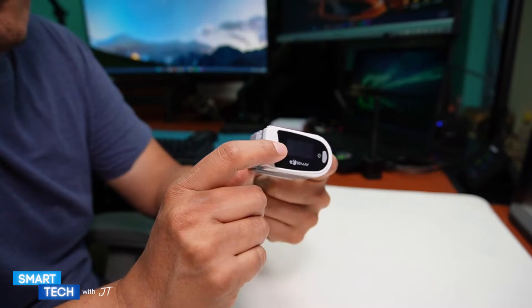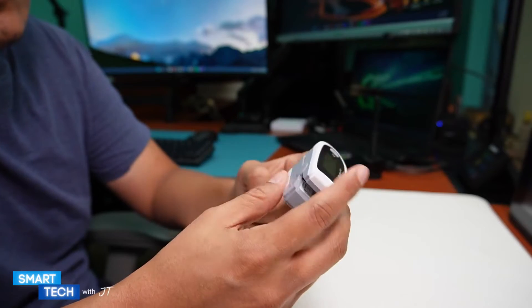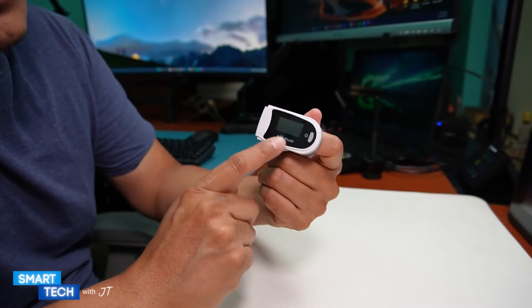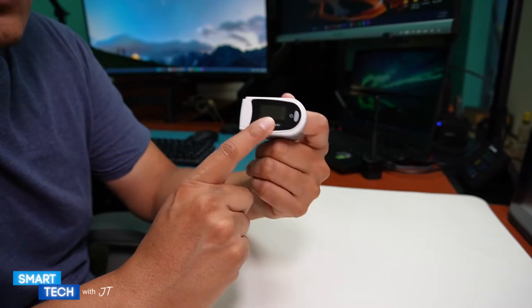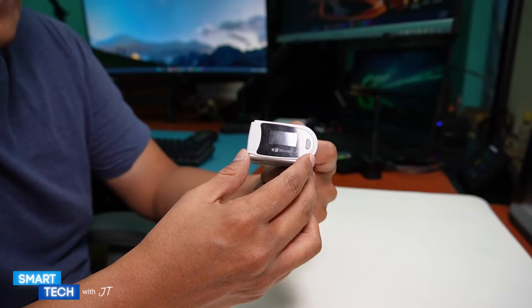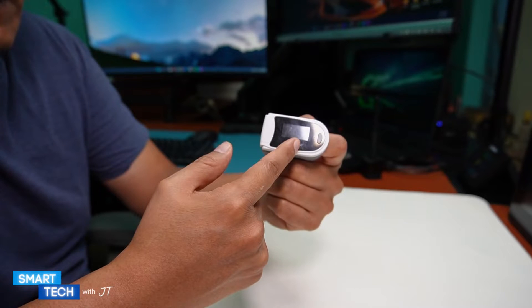It's a very valuable product if you're looking to register how your oxygen is doing. The reason I mainly purchased this one is that it can be used overnight — you can leave it on your finger, and it will register your heartbeat and your oxygen level.